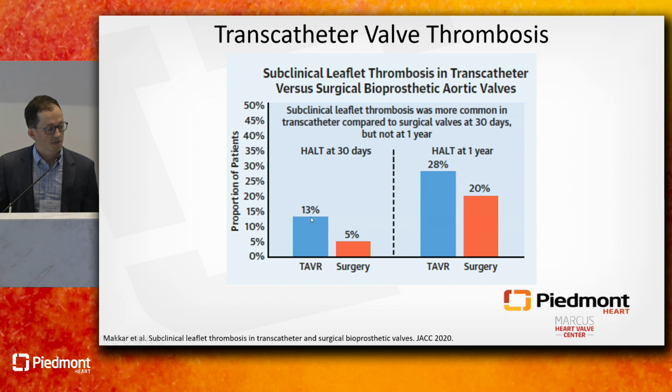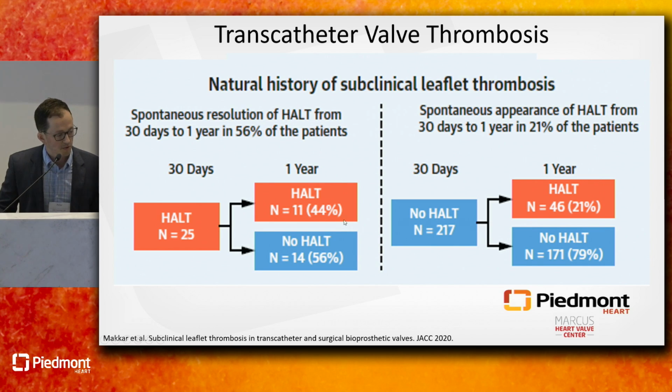It showed that HALT was a little more common in the TAVR valves compared to surgery. But I thought what was interesting is they looked at the natural history of these subclinical thrombosis. So these are patients that were having routine CTs. So at 30 days, they had 25 patients with HALT, but at 1 year, 56% of these, the HALT had resolved on CT imaging.